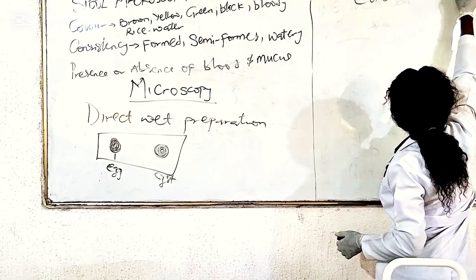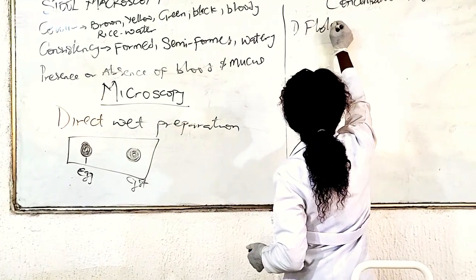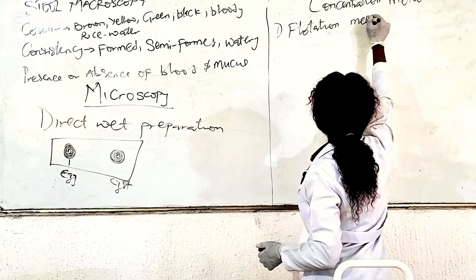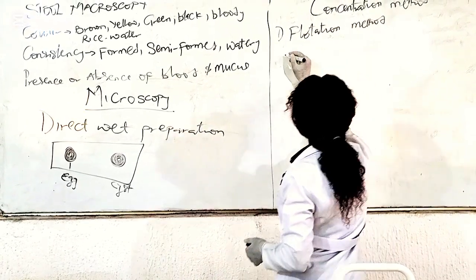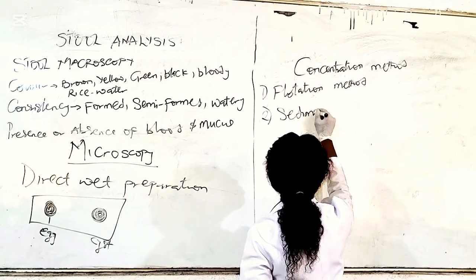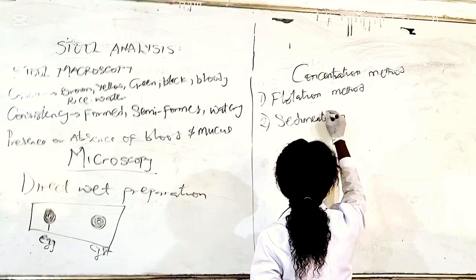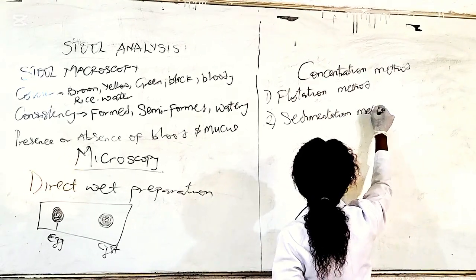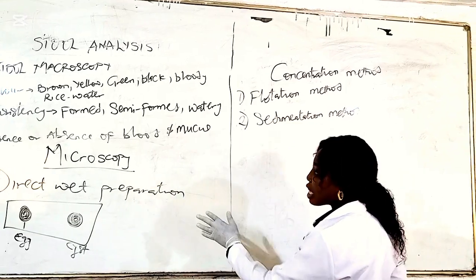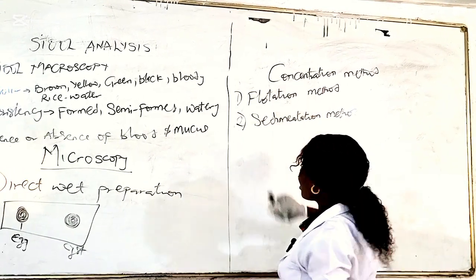The concentration method, we have the flotation method, and we have the sedimentation method. For the purpose of today's class, we'll be performing direct wet mount and flotation method.